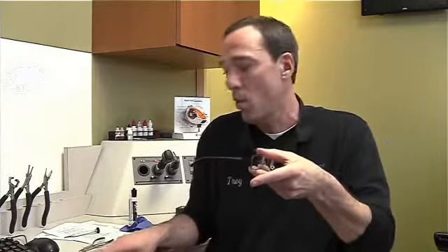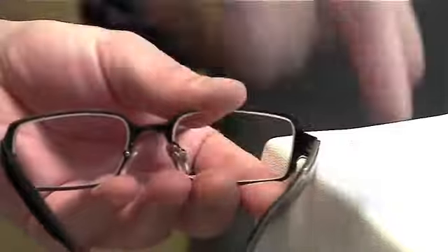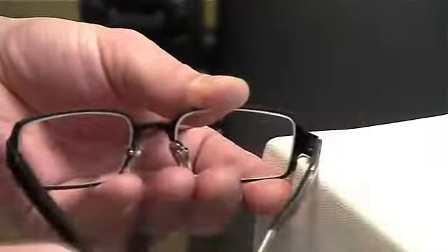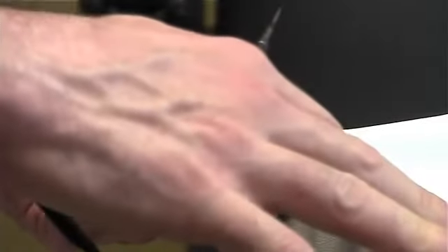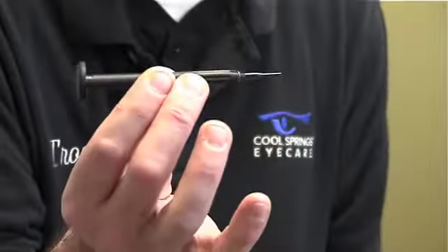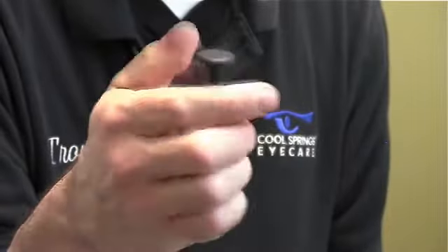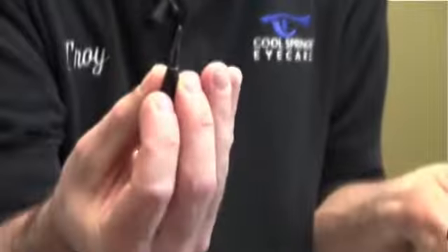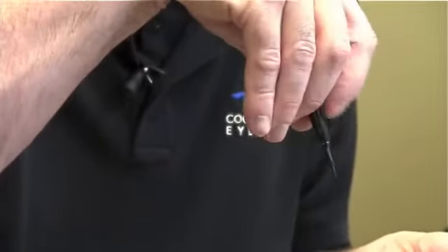And what we're going to do is try to find a tabletop or a corner. We're going to secure the frame on the corner of the table. And this could be a kitchen table, a desk, or anything that's firm enough to put pressure on. And now look at my screwdriver. This has a little swivel on the top for me to put in my palm. And this way, I can put pressure onto the screw and turn it slowly.